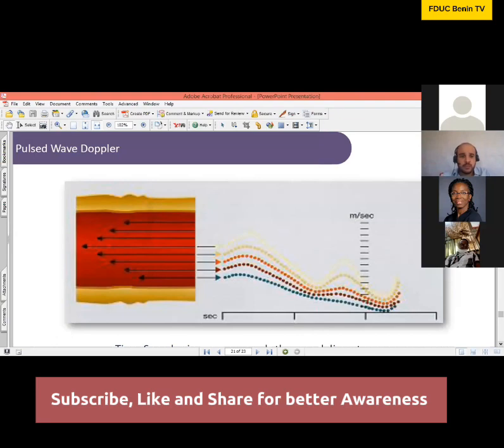Then what is also important, as you can see in this slide, is that according to where I am on the artery, I have different velocities. We don't have the same speed of the flow if I am close to the border of the artery or at the middle of the artery.